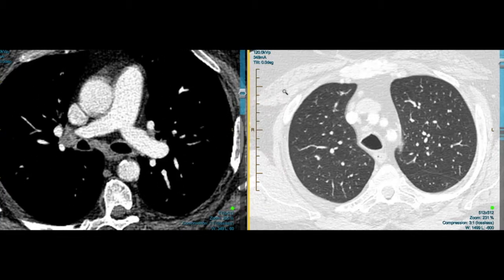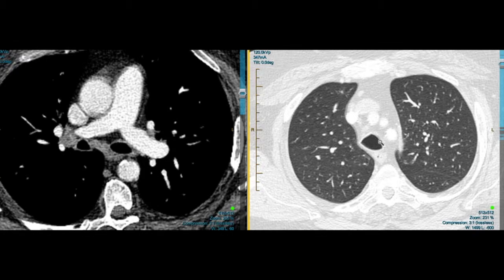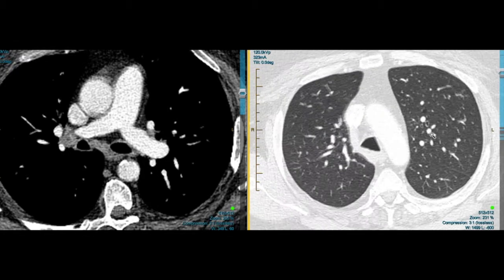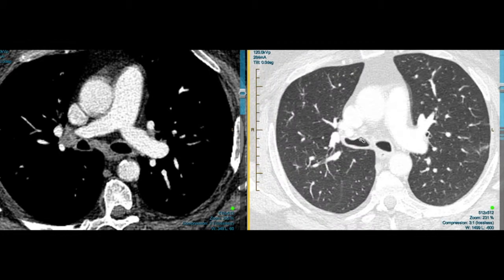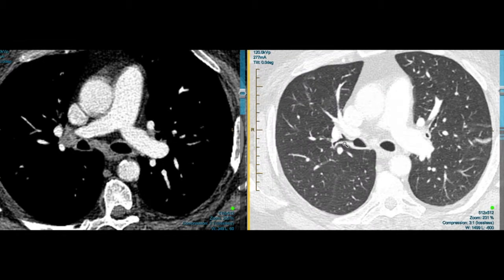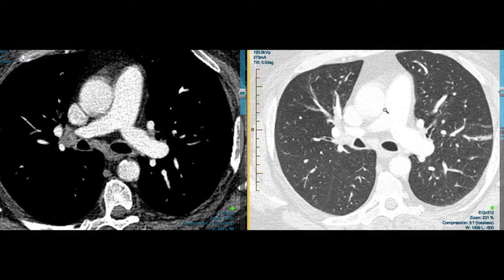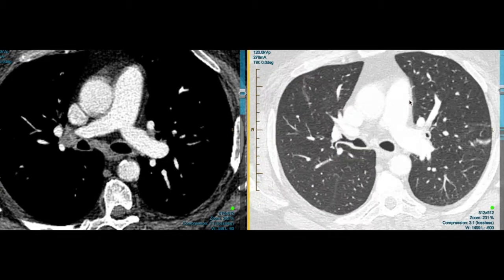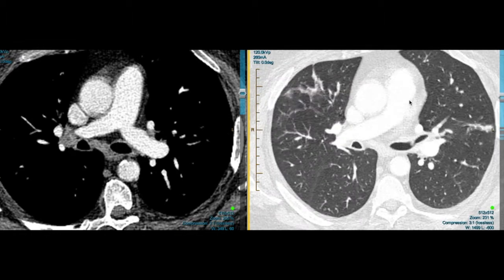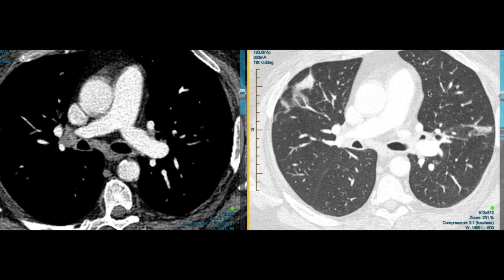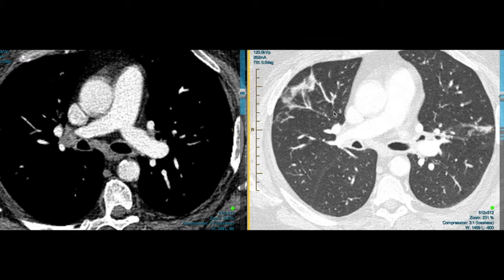If you look here at the lung windows, you can see these lungs look completely normal. Here's the trachea. Scrolling down now to the right upper lobe — here's the right main bronchus, right upper lobe — and just here we can see the posterior segment is clear. However, the anterior segment comes to an abrupt ending. There seems to be soft tissue here, and on the lung windows we can appreciate that there's some inflammatory change or atelectasis around the anterior segment, suggesting that there is obstruction or partial obstruction of the anterior segment of the right upper lobe.